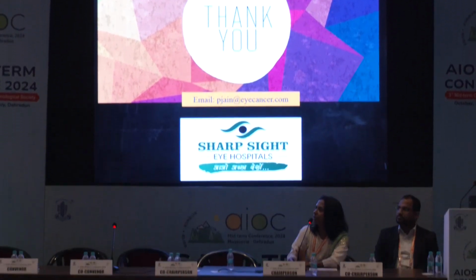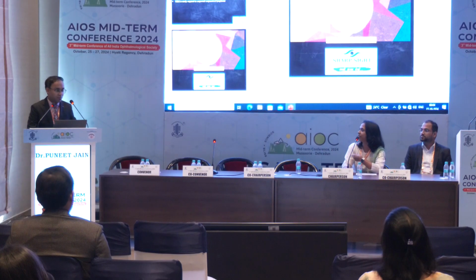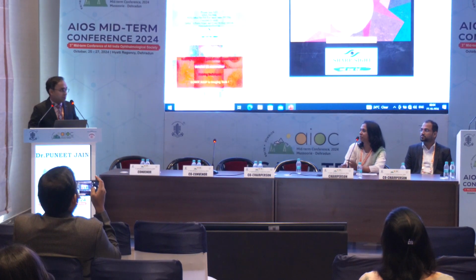Thank you, Dr. Puneet. That was a good insight into the use of ASOCT. Actually, we all have observed that ASOCT is much more useful and practical than UBM. Most of us, actually some of us, get trained to do it, but at the end we keep it aside and use the ASOCT.